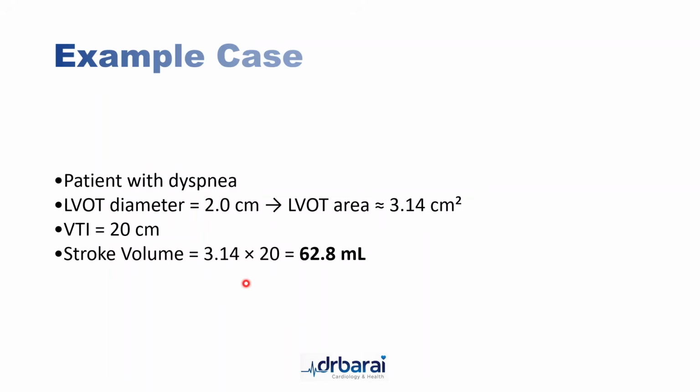What it necessarily means is that we have measured the LVOT VTI in a patient coming with shortness of breath. We have got a lot of differentials in our mind.